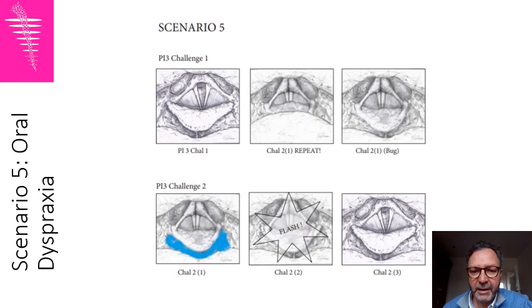So you're going to have several aborted motions of the base of tongue before having one effective. And once you have one effective, it's completely effective, and that's translated into a white flash, a classic white flash with a perfect clearance with no stasis at all. Let's see that on a real patient.